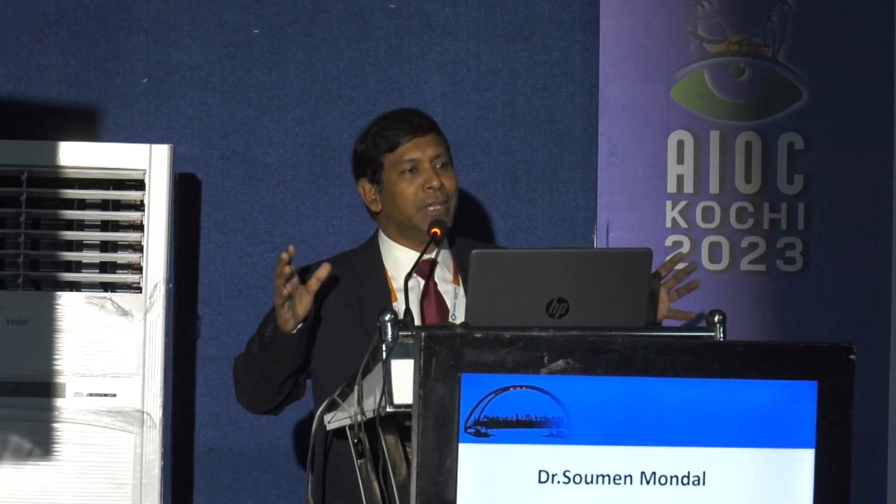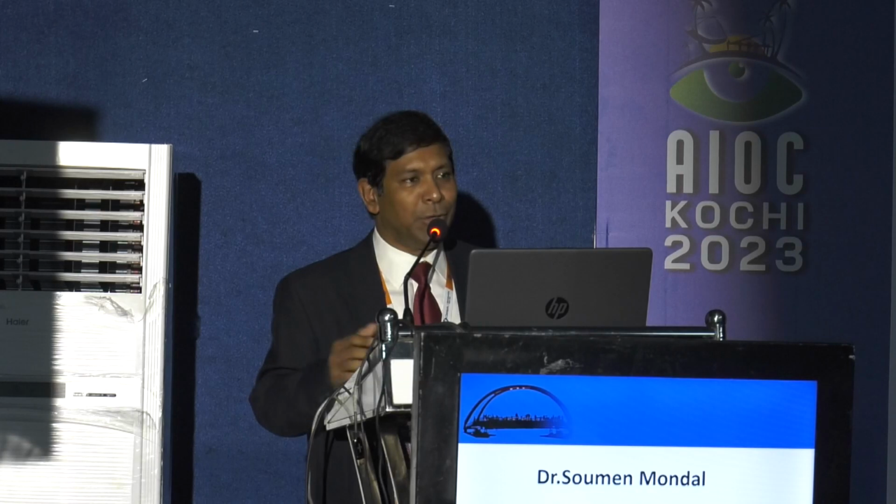My topic is on failed macular holes, where we have already operated and we still have a refractory macular hole. We have operated once or twice, and we don't have an ample amount of ILM to peel. And as we know, once it has been operated and it has failed, the hole tends to be even larger than what it was before.